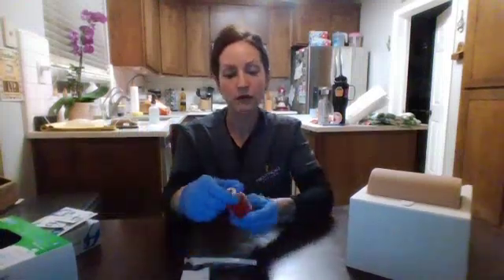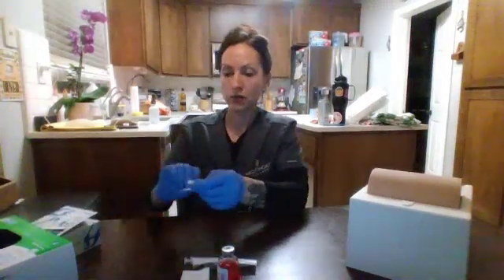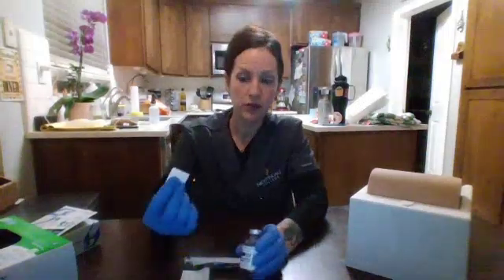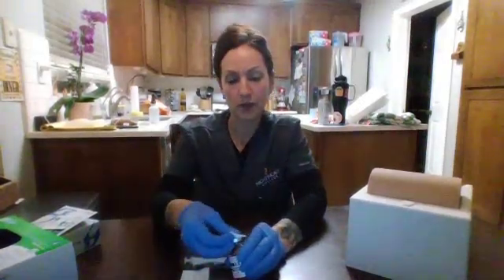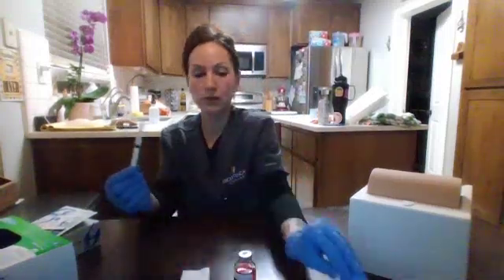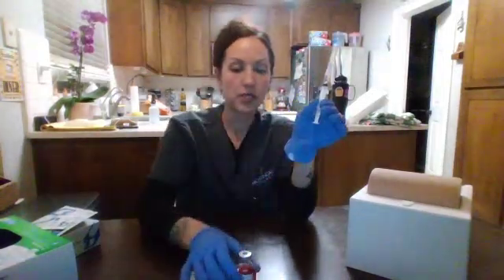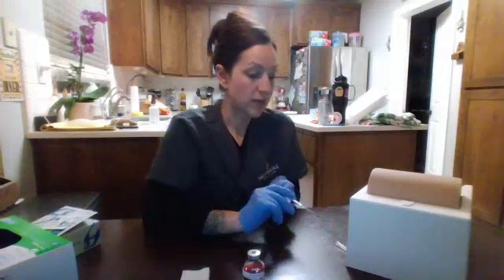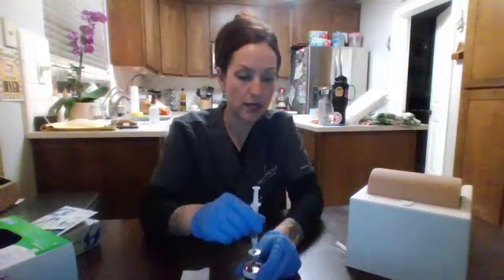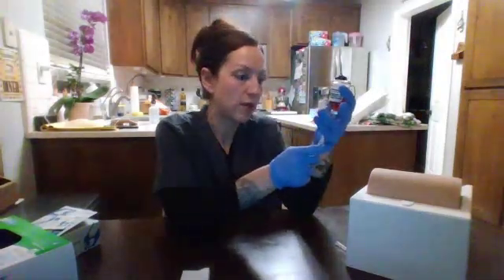I'm going to verify my medication. I have heparin. I'm going to clean the top of the vial using an alcohol prep pad, including the rubber top. I have my appropriate size syringe. And then I'm going to draw up 1 ml of air, which is equivalent to the 1 ml that I'm going to be drawing up from the heparin vial. I'm going to carefully remove the cap of the needle and then inject the needle and the air into the vial, invert, and then draw the 1 ml of medication.